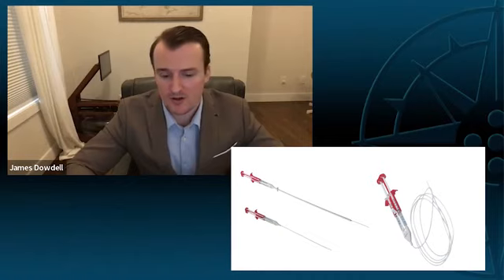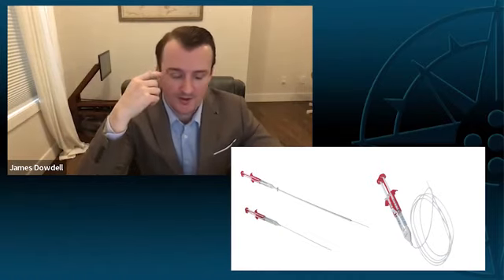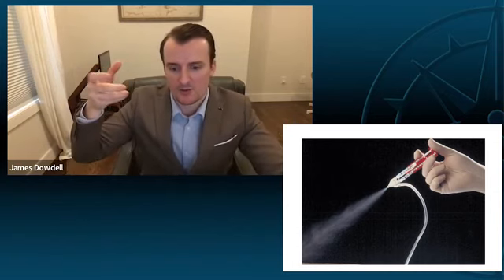And now ultimately, the way I spray a fibrin sealant, it's important, is I don't want to put it right on the wound. I want to actually step a little bit away because it works by integrating with itself. So you don't want to put it right in the area of concern. You actually want to spray it from up above. So I think that's an important component to any fibrin sealant. You kind of want to pull away from the patient a little bit and just spray it like a gas, essentially. So thanks for the excellent demonstration and discussion, Michael.